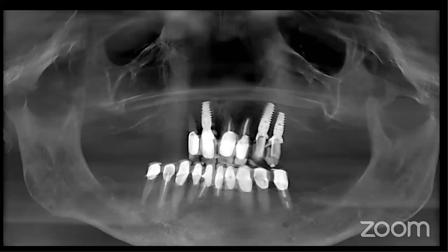This particular patient is 80 plus years old. You can see he's had a handful of implants. He's lost his posterior dentition. Now he comes to see us because, as you can see, he's got a number of root canal treated teeth, a number of short roots. He also has a few implants in the anterior. But if you're able to see the CBCT on this, the bone up there is very, very thin. And the facial aspect of these implants is sticking through the bone in many cases. So there's not a whole lot of bone up there.